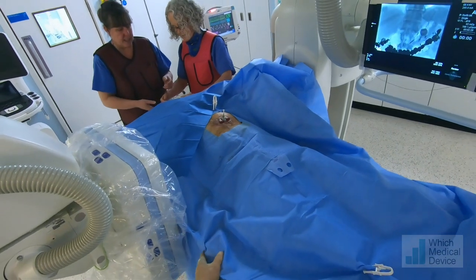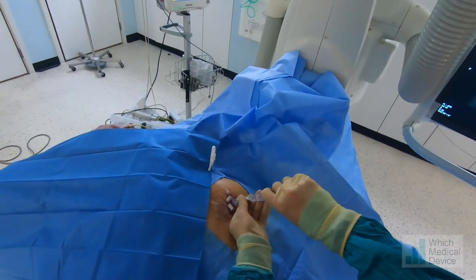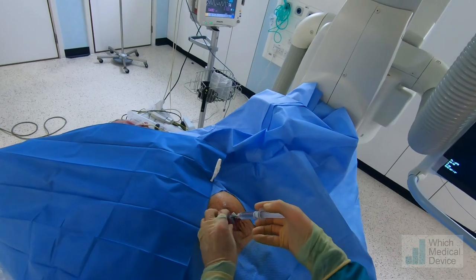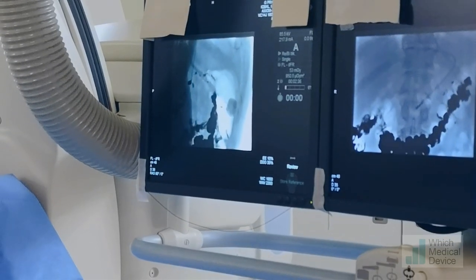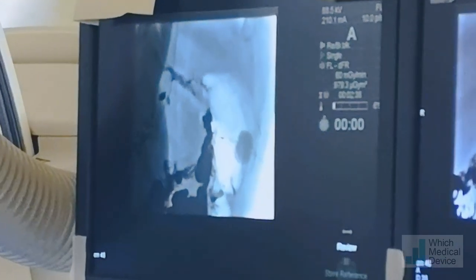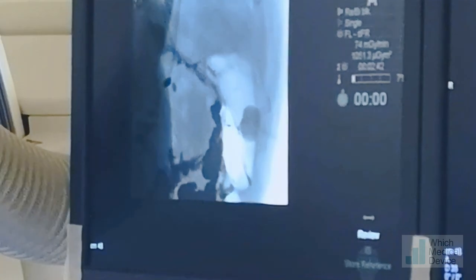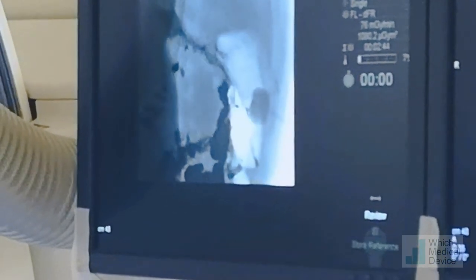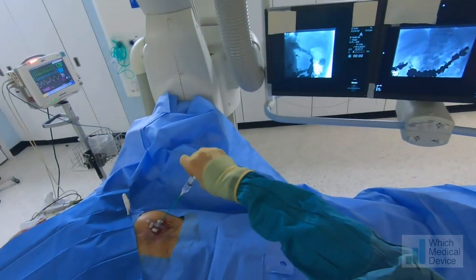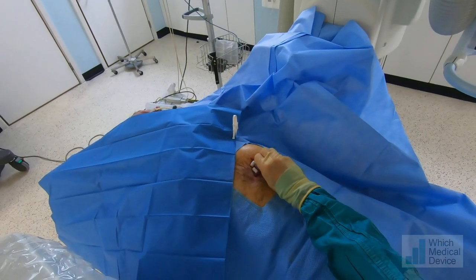Drop the table down — there you can see the tube placed within the stomach. We're going to take some neat contrast and inject it into the dilator and back into the tube to check there's not a flap of mucosa sitting over the top. You can see the contrast falling freely into the stomach, confirming the balloon is not lying in the tract. By the way it moves, it's in the right place. If there was any doubt we could do a cone beam CT to check, but I'm happy with that.